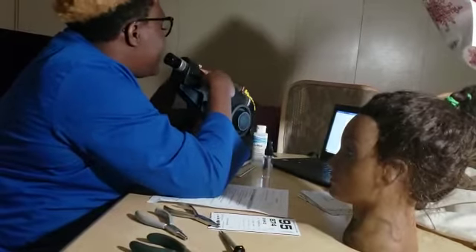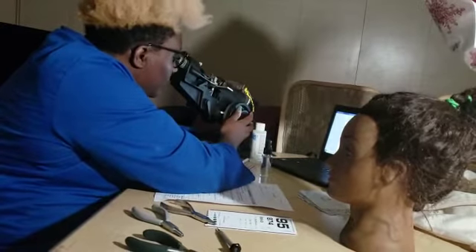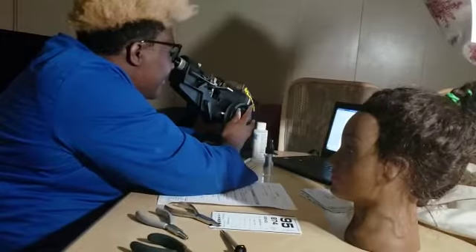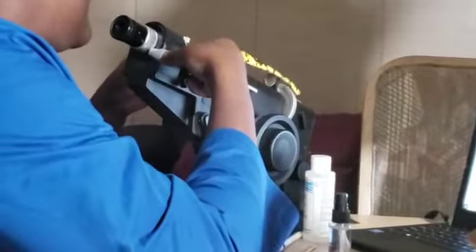Now we want to check our reading portion. We move on to our reading portion and verify that it is at a plus 1.75. We verify that it is at a plus 1.75 and it looks clear on our end. Now we would move on to our left lens.